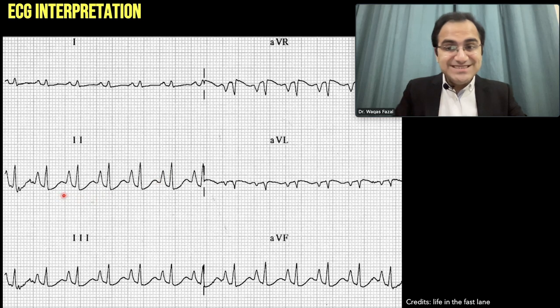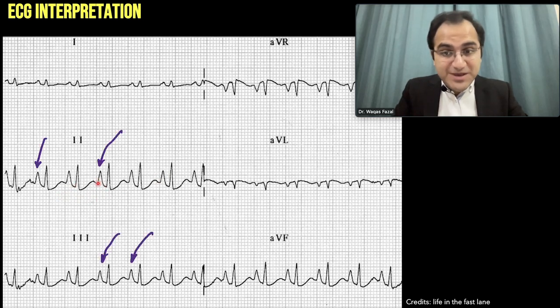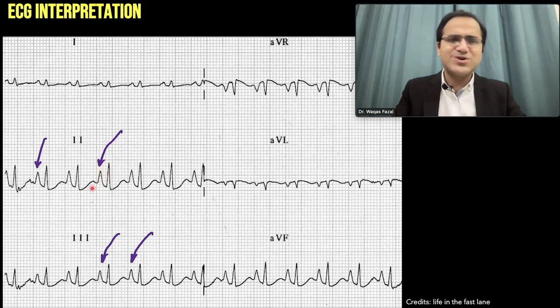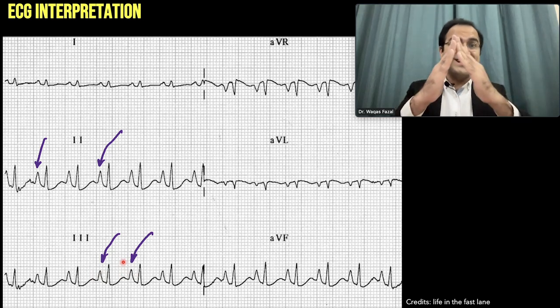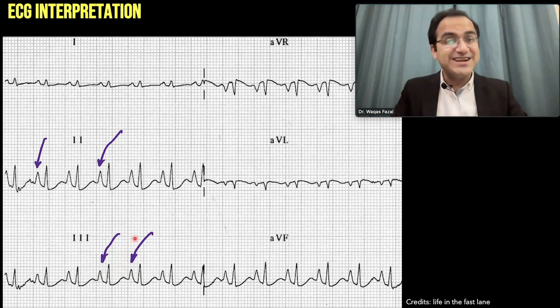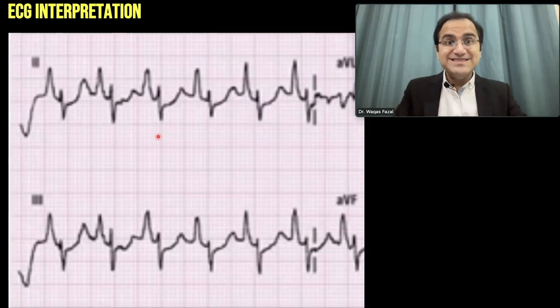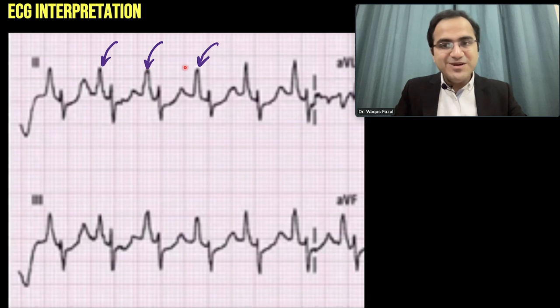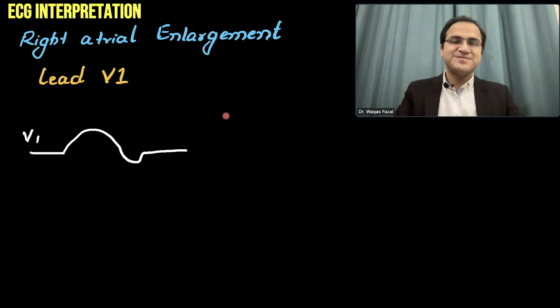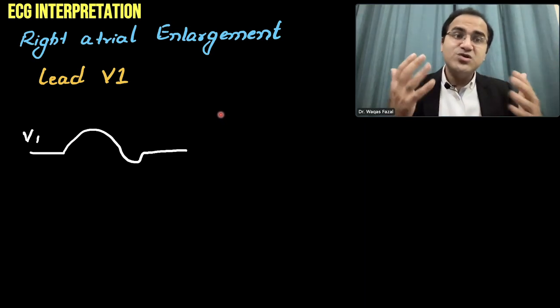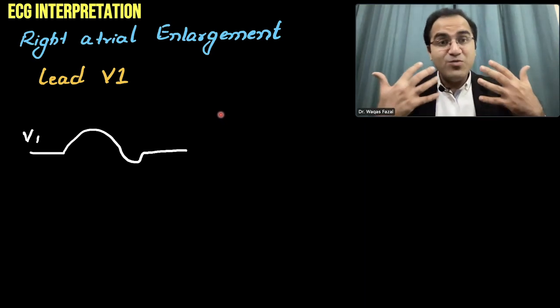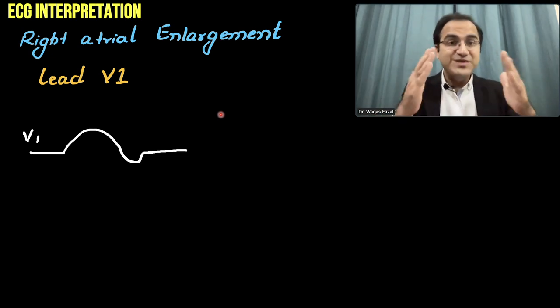If you look at this ECG, you will be able to appreciate the peaking of the P wave. This is the P wave, followed by a QRS complex. Look at the tall, peaked P waves that have pointed ends — that is a classical feature of right atrial enlargement called P pulmonale. This is another ECG with a closer look. In leads 1, 2, and 3, you will be able to appreciate the P pulmonale — the tall, peaked P waves.